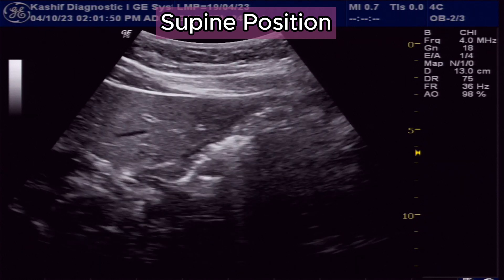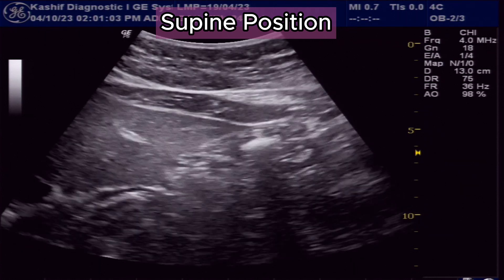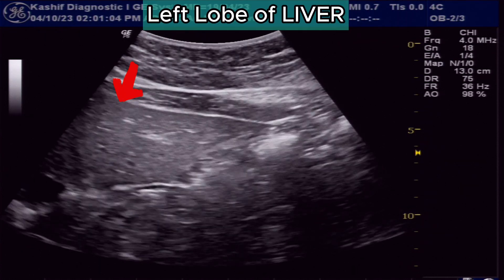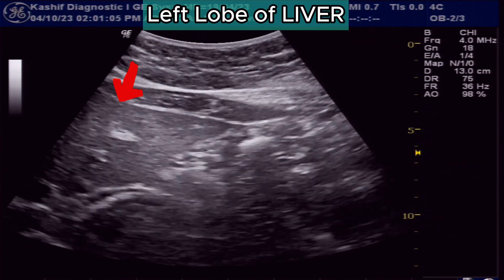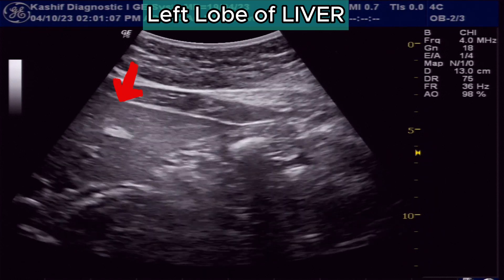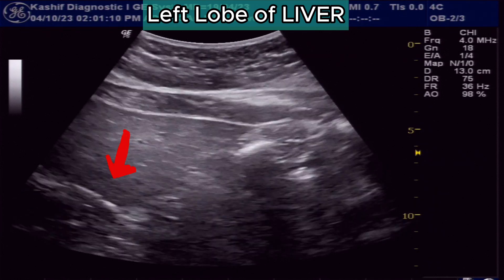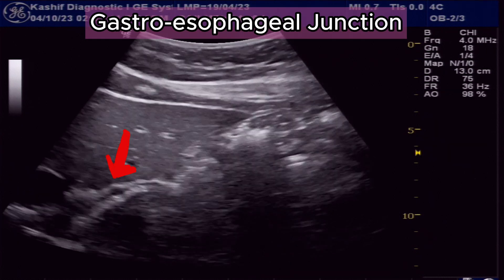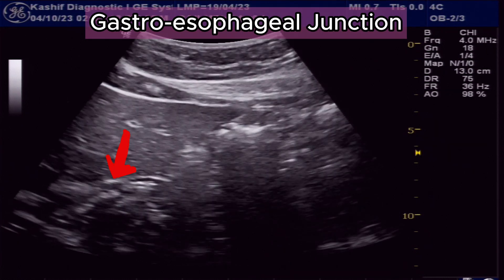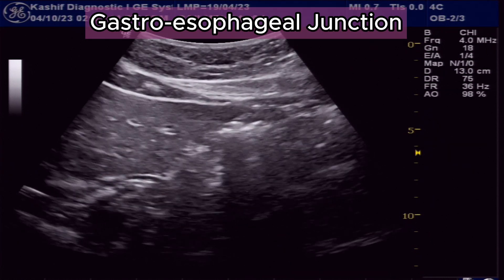In this case the patient position is supine. The left lobe of the liver is visualized. Posterior to the left lobe of the liver we see a tube-like structure — this is the gastroesophageal junction.